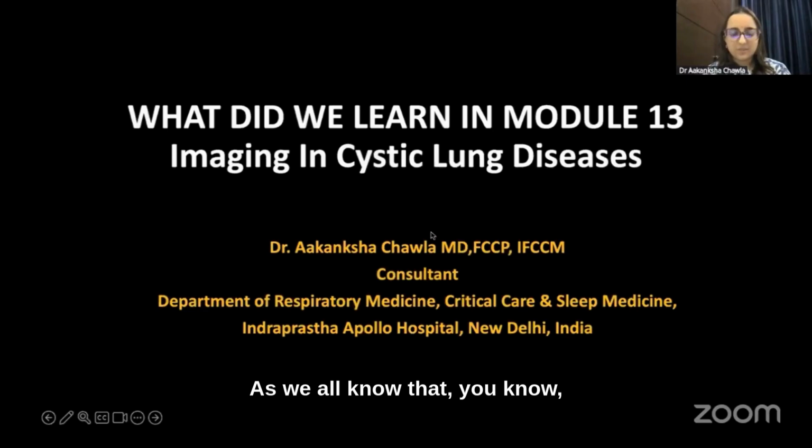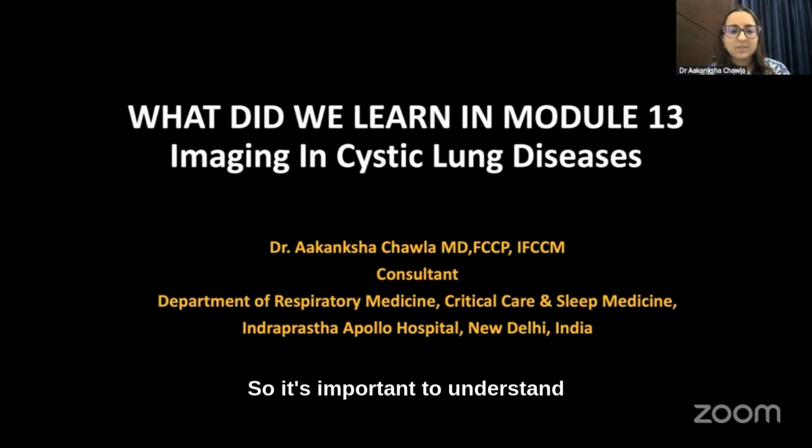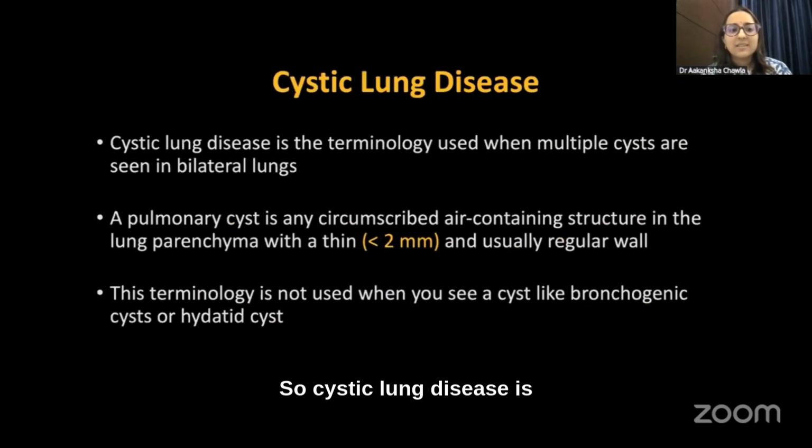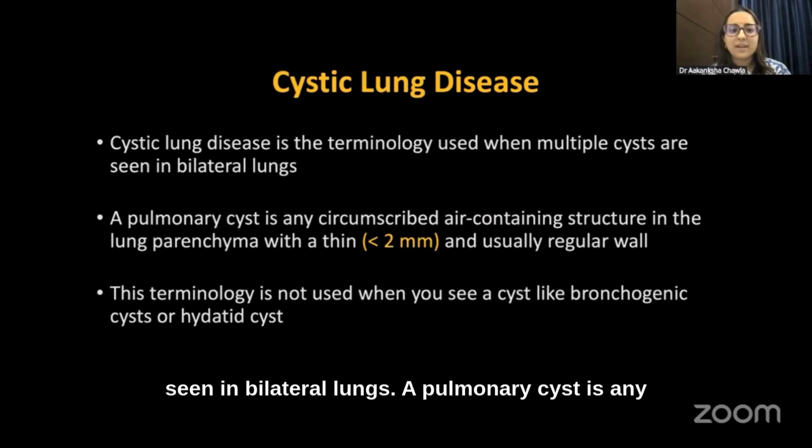As we all know, cystic lung disease is something that we either overlook or underlook. So it's important to understand the basic aspects, know the common presentations, and how to proceed. Cystic lung disease is the terminology which is used when multiple cysts are seen in bilateral lungs.